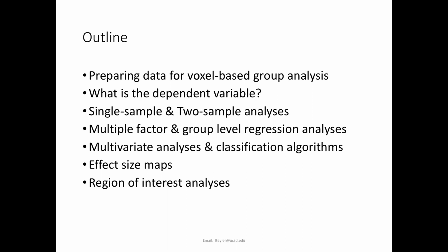So then we're going to talk about pretty simple single sample analysis. So what you do if you have one group of subjects and you'd like to say overall, where did they activate in the brain? And then two sample analyses, where you have two groups or one group at two occasions and you're trying to compare the activation between those two occasions, two samples.